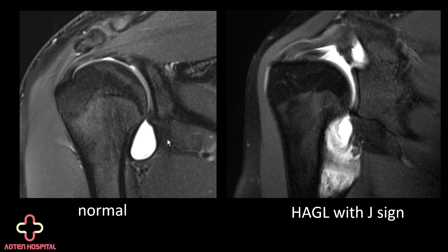Then we have the HAGL lesion, which is a humeral avulsion of the glenohumeral ligament, meaning that the inferior glenohumeral ligament is avulsed from the humeral attachment. You can appreciate this here — we have the same structure, but it's frayed and torn, and it should actually belong up here, but it's torn.